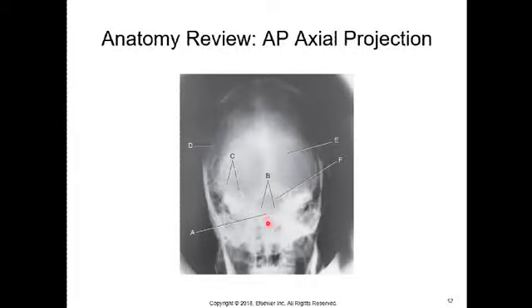It's even harder to tell on a plain picture or on a plain piece of paper. So just be careful here, but this is the dorsum sellae over here. B is pointing to this section here. So this is actually your sphenoid, if you can see it. I know it's really hard to see. I'm blind, so it's even harder for me to see. But this is your sphenoid. And then here are your posterior clinoid processes.